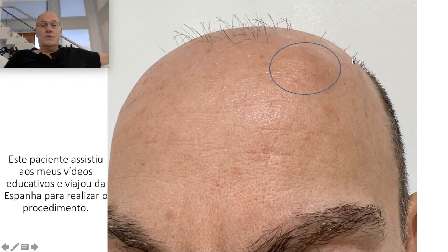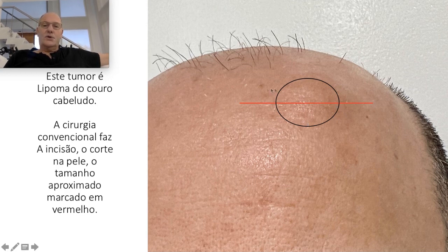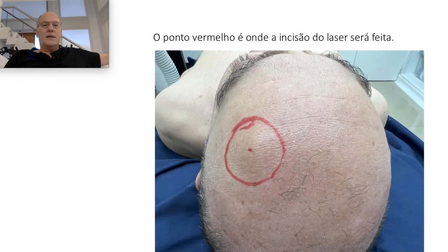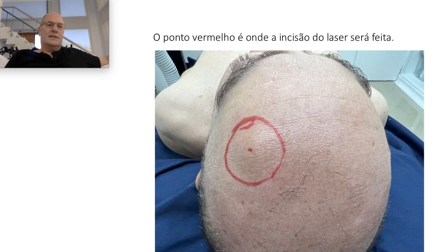This is the size of the tumor. This type of tumor I generally remove with general anesthesia and with a resection of this side. I developed a new technique based on laser technology and also on my 40 years of experience as a plastic surgeon dedicated to reconstructive surgery, aesthetic surgery, and laser.